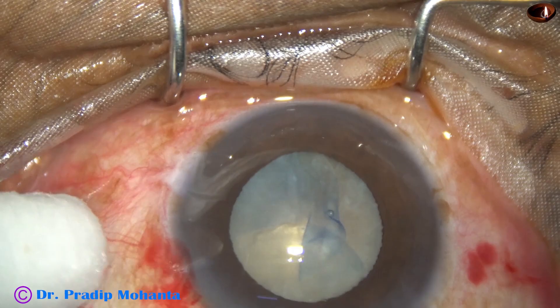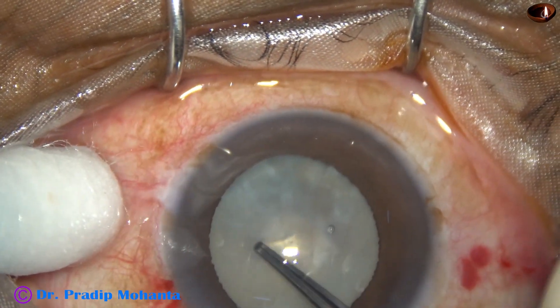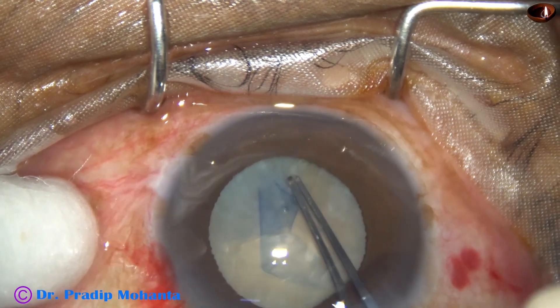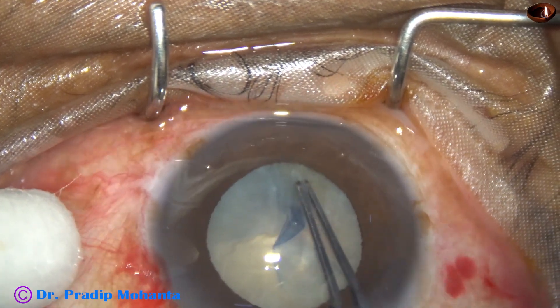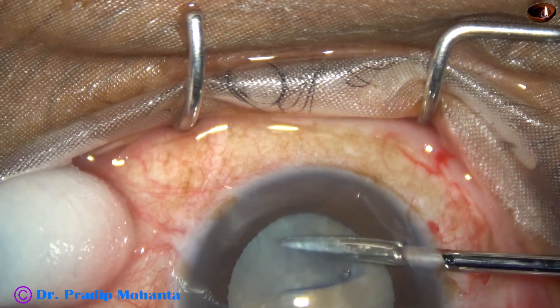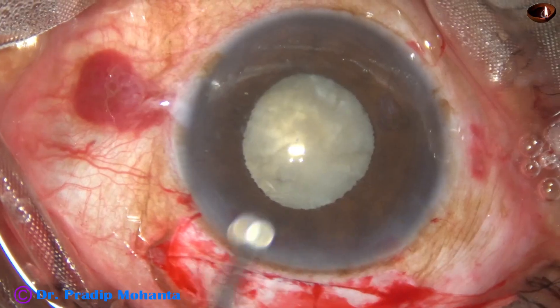This is another case. There is fibrosis of the anterior capsule inferiorly. As I try to do the rhexis, it goes nicely, but at around 6 o'clock to 6:30 o'clock, there is a fibrosis band and the rhexis goes to the far periphery. If I try to pull it, I can detach the zonule and cause a lot of damage. So I take a micro scissors, cut the capsule, complete the rhexis, and convert to SICS.